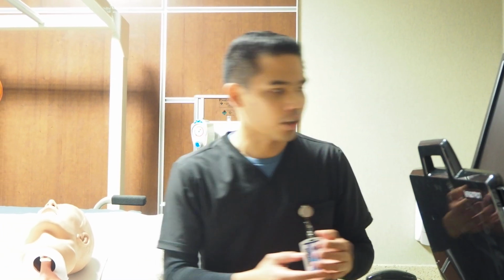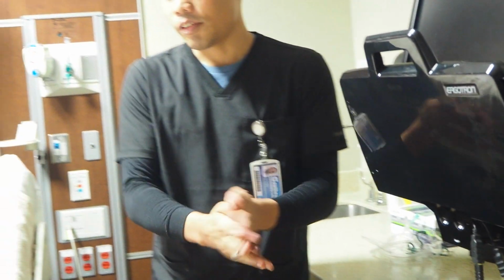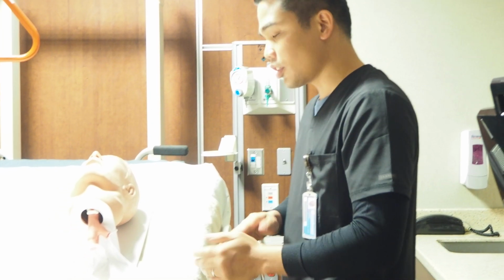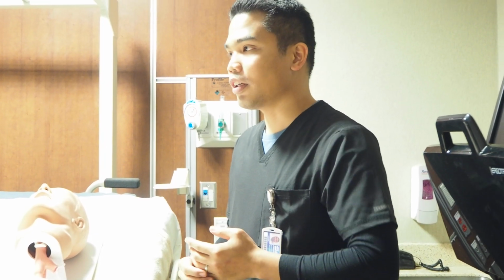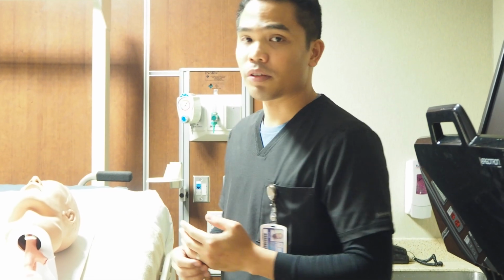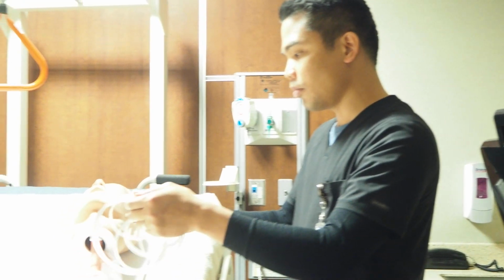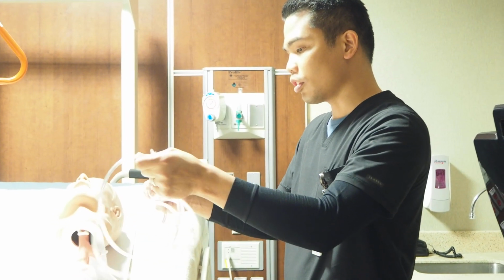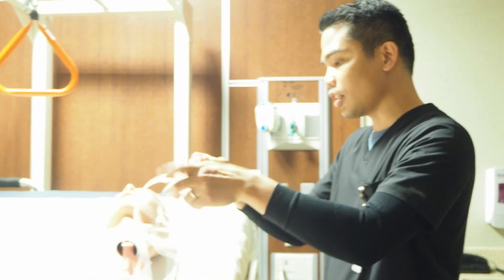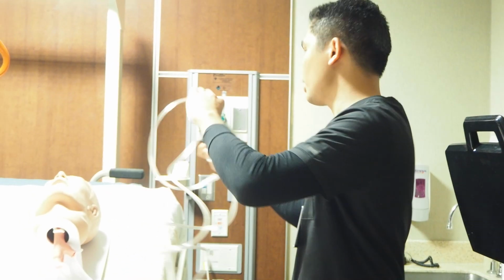So first I will sanitize my hands, or wash my hands, and after that I will always make sure to check the patient's chart, especially for what specific device or flow the doctor would like the patient to be put on. Because the doctor wanted to hook the patient up with a nasal cannula with a flow of 3 liters.